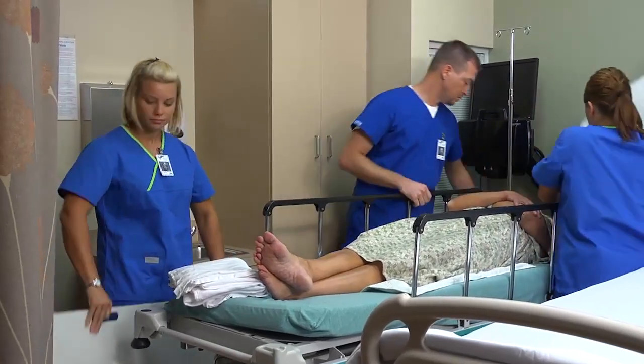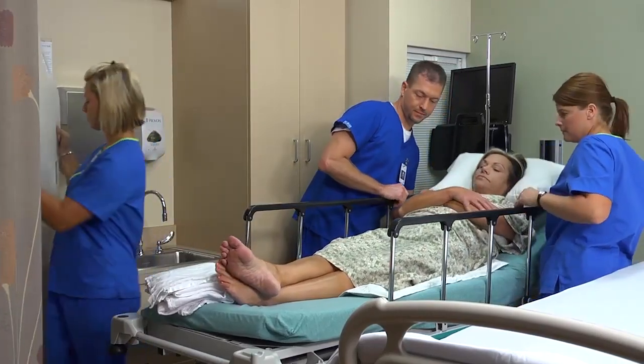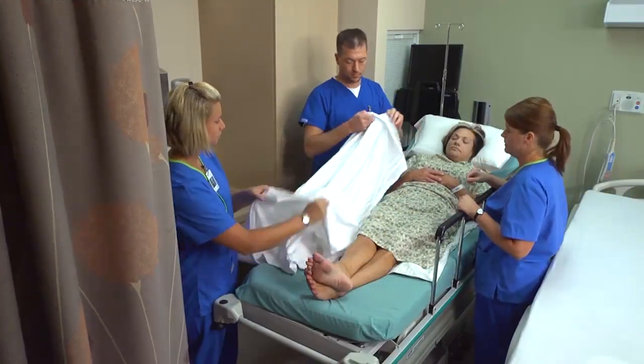Raise the side rails on the stretcher. Raise the head of the stretcher if doing so is not contraindicated, and cover the patient with a blanket.